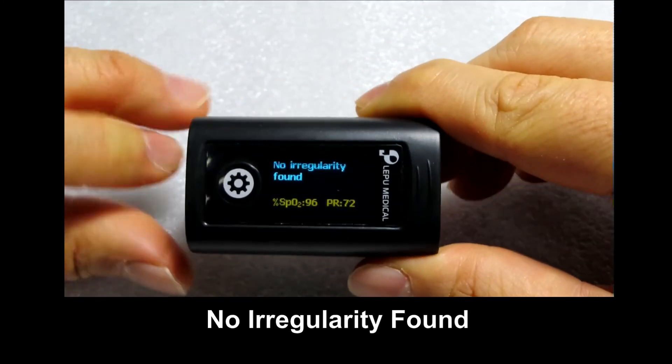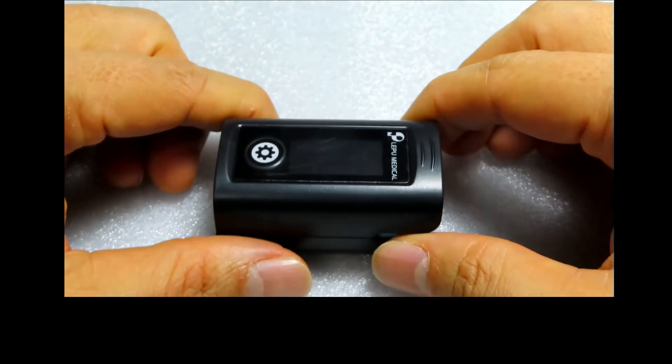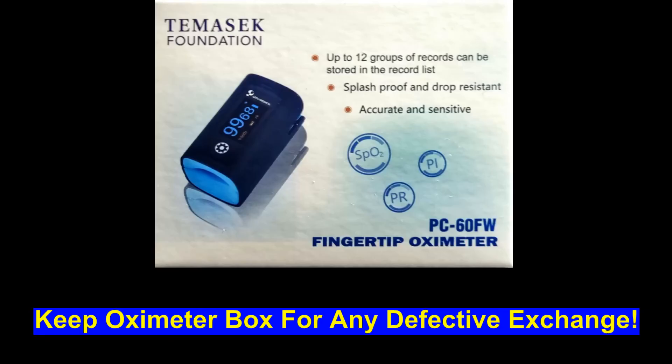It's telling me there's no irregularity found. This is how you use a finger oximeter, and that's the end here.